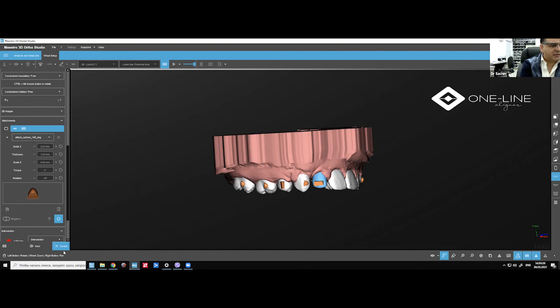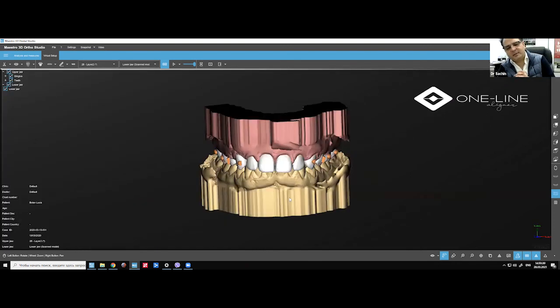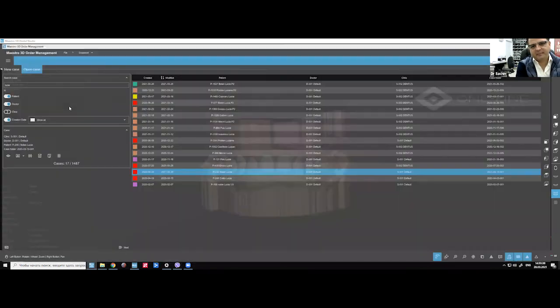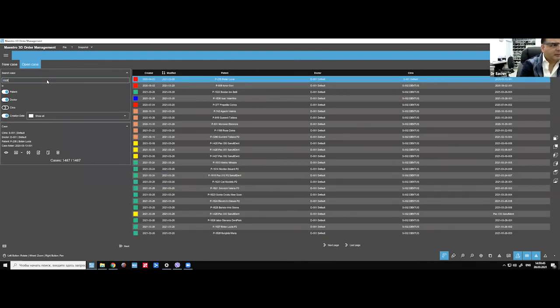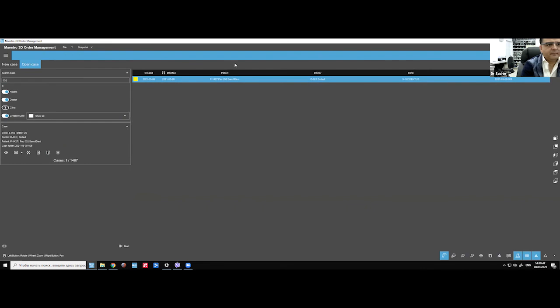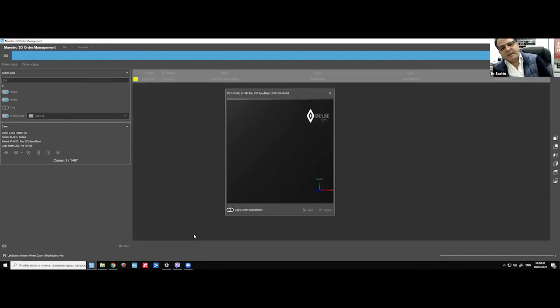So I just like to show you one patient also. We did some changes with the attachment. If I find that, I like to show it with you and just share it with everybody. This is for intermaxillary elastics. So this patient needed intermaxillary elastics.